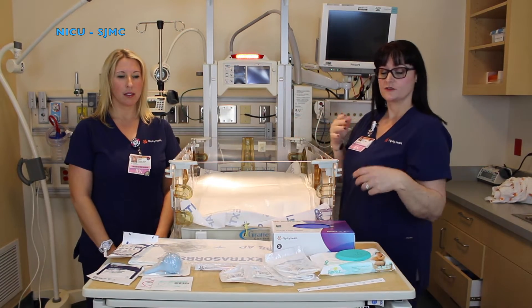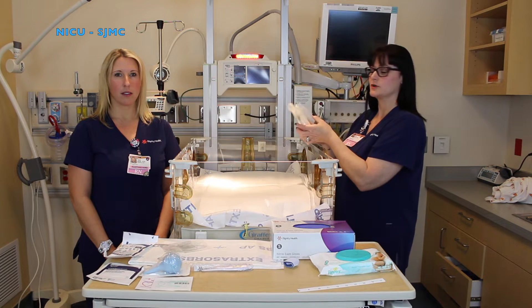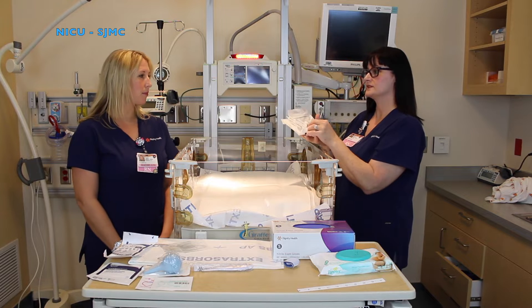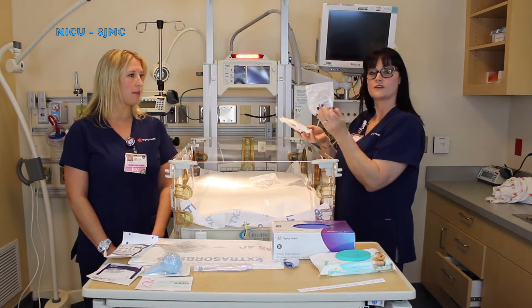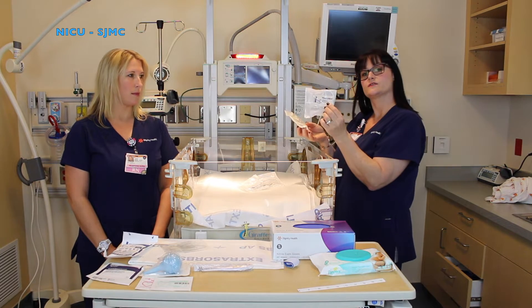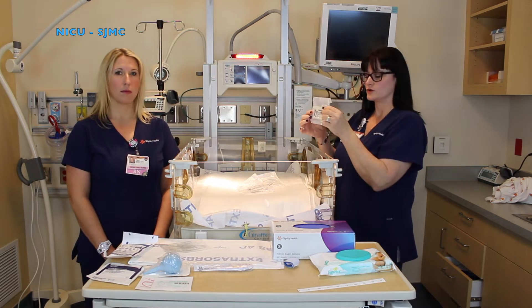One of the next items you're going to need for your admission bed is a blood pressure cuff. You're going to choose the size of your blood pressure cuff based on the type of baby you think you're going to be getting. A size 1 cuff would be for a micro preemie size baby. A size 2 cuff is for a regular preemie baby. A size 3 is for most newborns and a size 4 would be for your larger newborns.